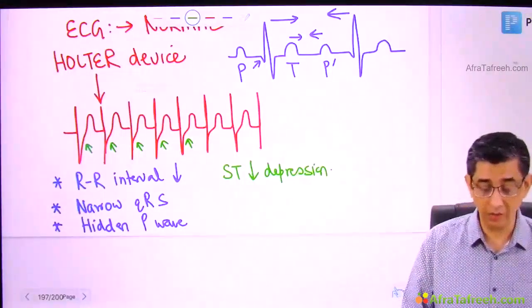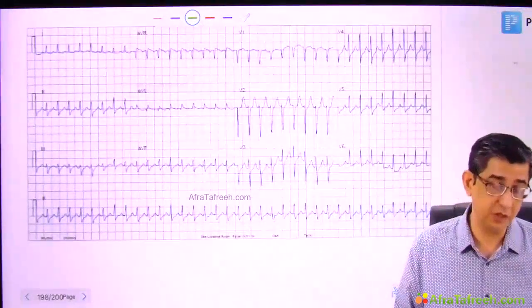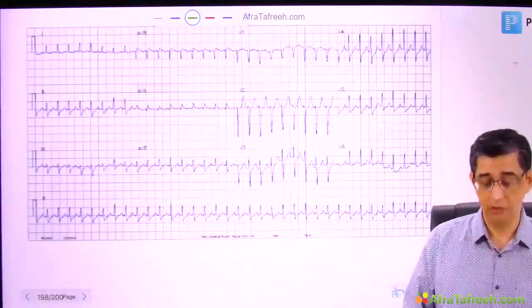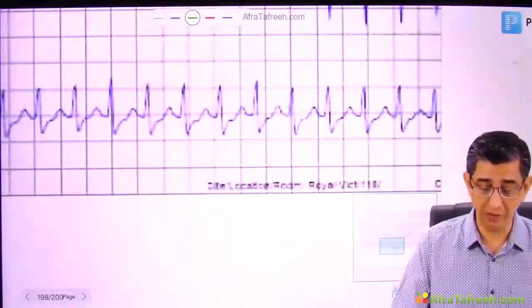Now is the time for treatment of this particular person. So let's look at what we can do to prevent such aspects and what's going to happen if she presented in the casualty with an acute presentation like this. This is the actual image that I was talking about. So let me just zoom it in and make you more comfortable with this.